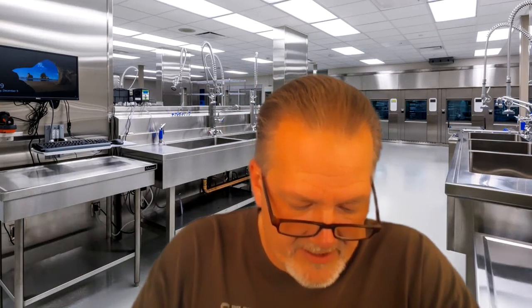They should also notify us about things that need to be turned over or turned around. So a turnover turnaround is when you need something back to the OR or to the user department for a same-day case. Example would be, let's say we have 2 craniotomy sets and there are 3 craniotomies scheduled. Well, our department, doing its due diligence, is probably already aware that we're short by 1 set. However, the OR or the user department should also inform us that they're bringing us a set that needs to be turned over or turned around for a later case. If they fail to do that, I can't help you. They usually do it.